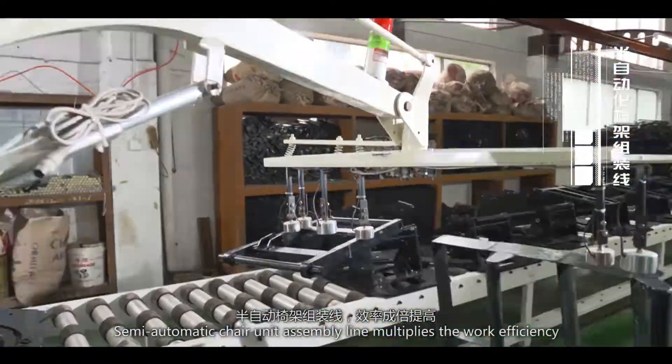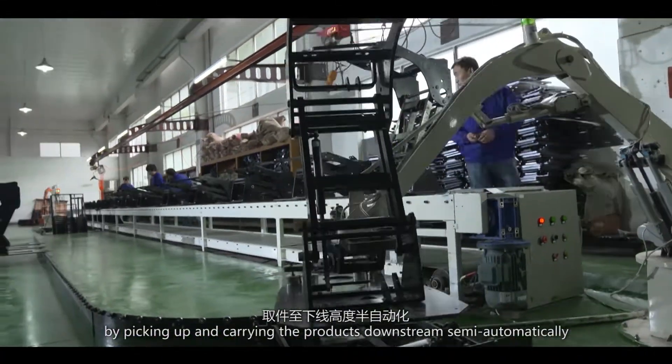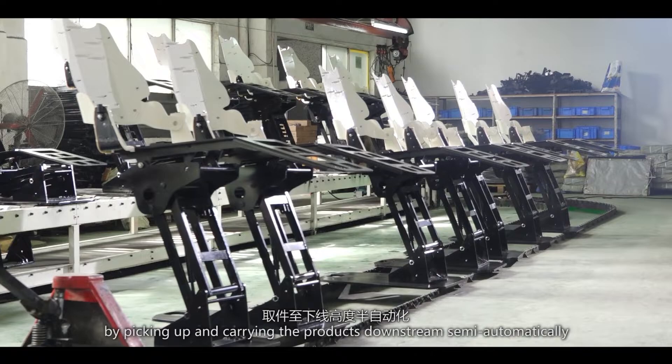The semi-automatic chair unit assembly line multiplies the work efficiency by picking up and carrying the products downstream semi-automatically.